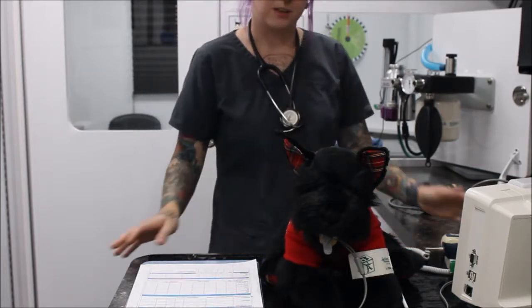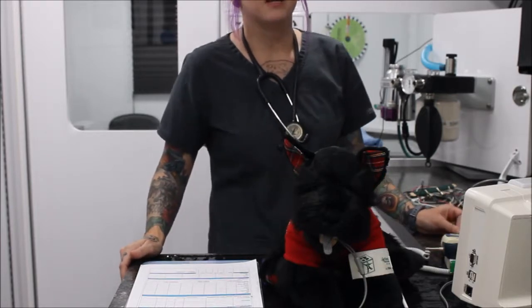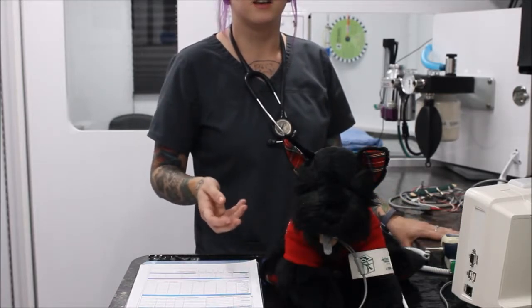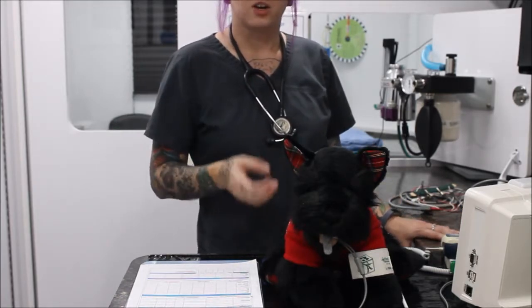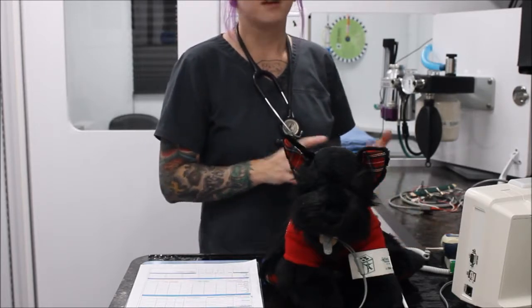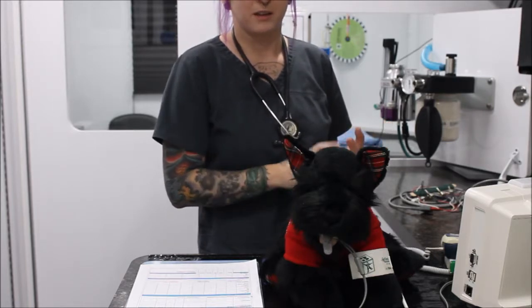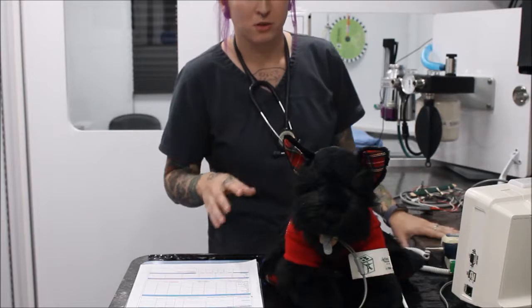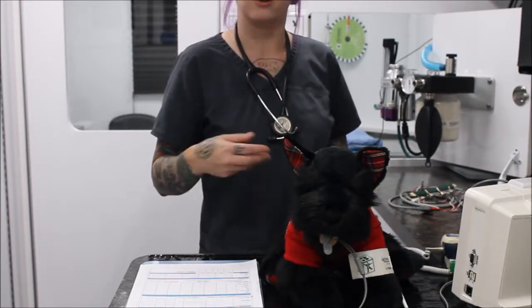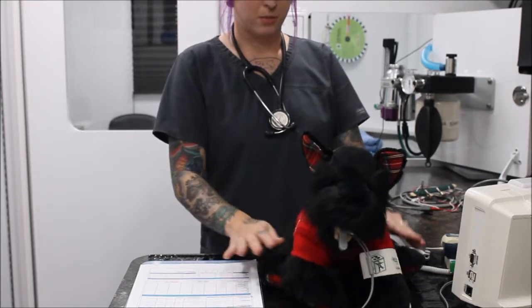If there is a decrease in blood pressure, we'll alert the doctor, but we might need to turn the anesthetic down and increase IV fluids, and monitor all the other parameters as well, making sure the heart rate is okay and not dropping, that SpO2 is okay, and that tissue perfusion looks all right. If those are all okay and the blood pressure is dropping, you might just increase the fluid rate. So that's just another one that we do monitor.